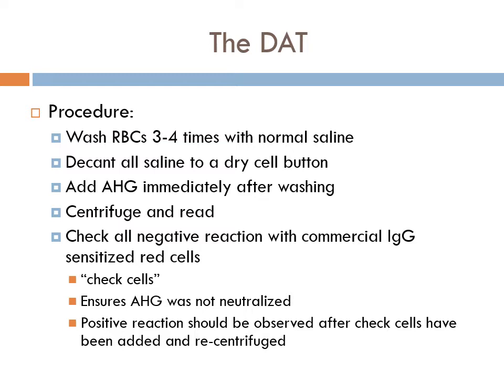So kind of going over this a little bit, we wash these red cells to begin with because we haven't technically added anything to it, it's just patient red cells. We want to remove any unbound proteins that may bind to the anti-IgG and neutralize it. We add that AHG immediately after washing to prevent globulins from dissociating. We don't need an incubation phase with this procedure because the antibody-antigen complexes are formed in the body.